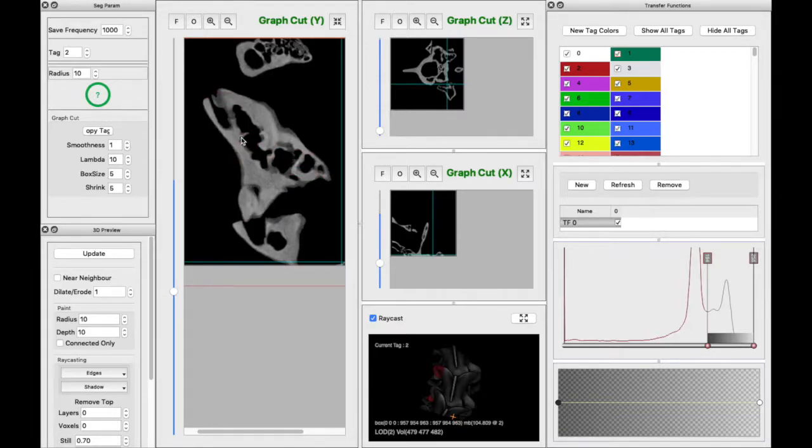Yeah, no, it stays a little bit, so let's color it in and then tag the rest of this junk. Some little things in there need to be tagged. And let's erase this tag. Actually, I'll press escape because you can see there are those little things that were gonna stick around if I had just done the right click erase function. And this pretty much looks like part of that. So I'm gonna call it good and we'll check that in another view further down.